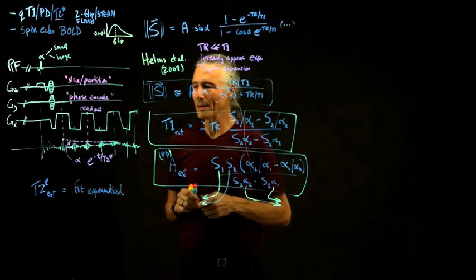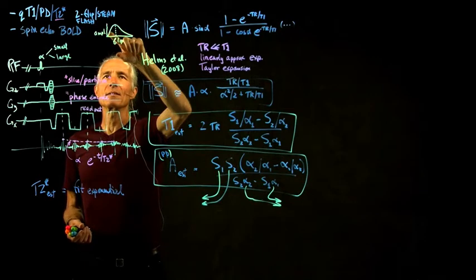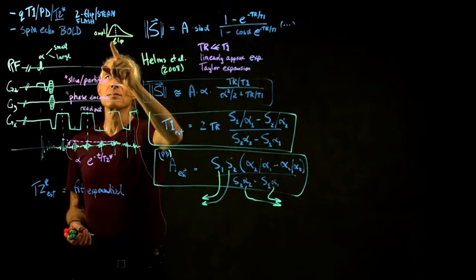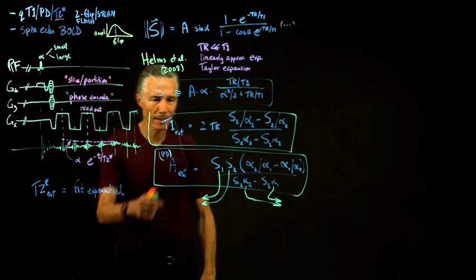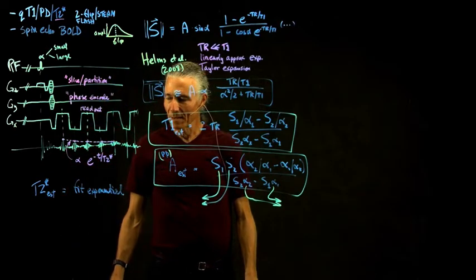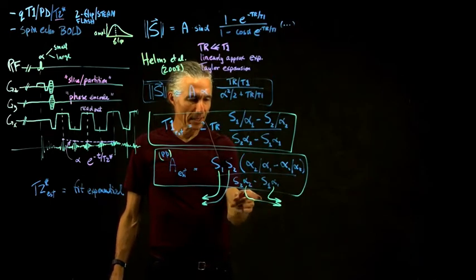But that's quite a bit, because this whole equation is based on flip angle. The signal amplitude depends on the flip angle. Small changes in flip angle, like 1 or 2 degrees, a 5 or 10% change, can cause a marked difference in the brightness. That's going to completely mess up our estimate, so we would really like to know what the flip angle is.